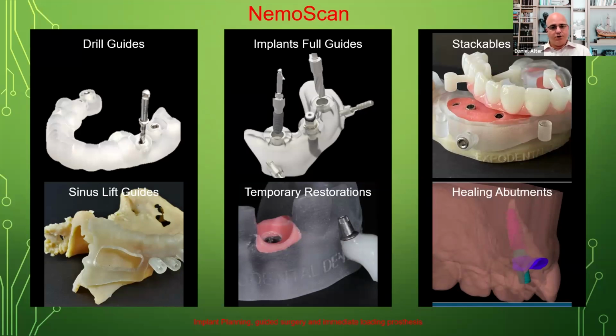So there's a very good chance and a very good likelihood that some of your clients would be interested, or if they're not interested, they're doing it currently right now, that this could absolutely help them. So if you're not doing surgical guides, I suggest you inquire about it and take a look at it, because it could be a benefit for not only your existing dentists that are currently doing it, that you can help them really fulfill a revenue stream, but perhaps there are some clinicians within your network and within your business that desire to be able to place implants.